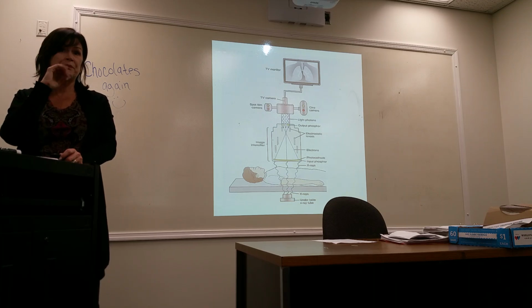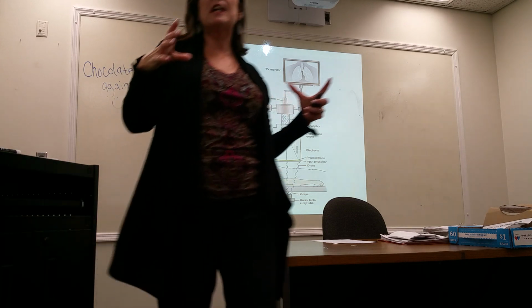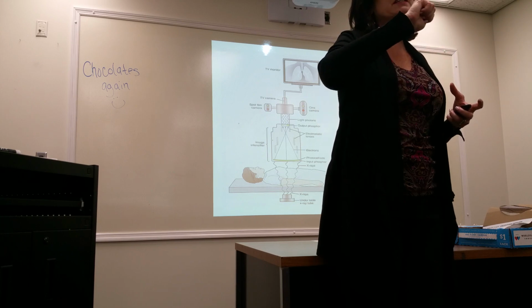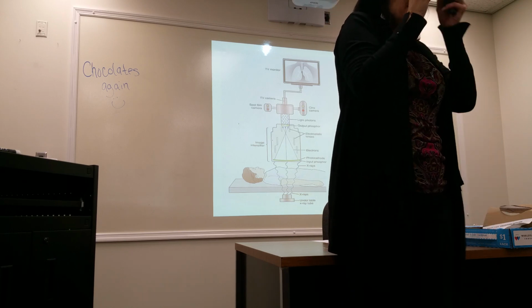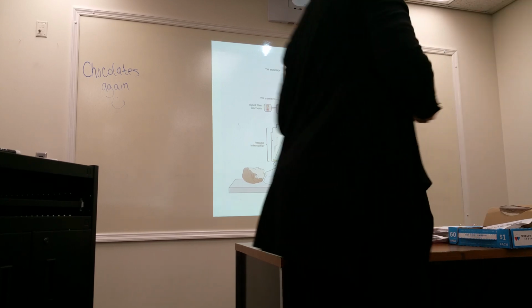The input phosphor can be different sizes. There's a 12-inch, you can go smaller, 9-inch or 6-inch, but the output phosphor is typically 1 inch. Okay, 1 inch, so about the size of a quarter. So you're not going to sit there and look at a little teeny tiny image, right? You need to magnify it and be able to see it.